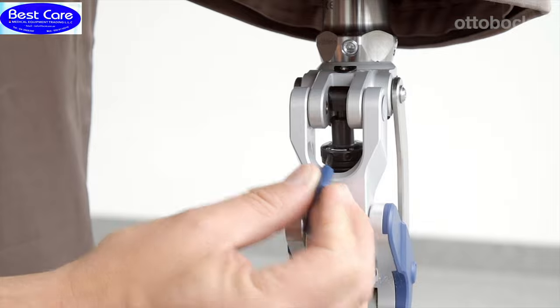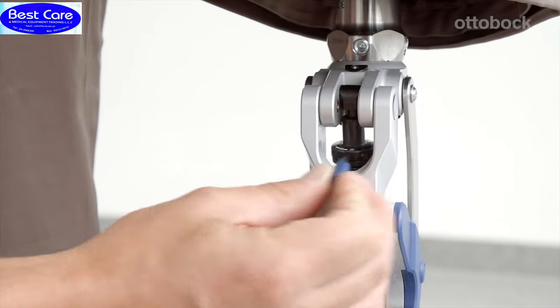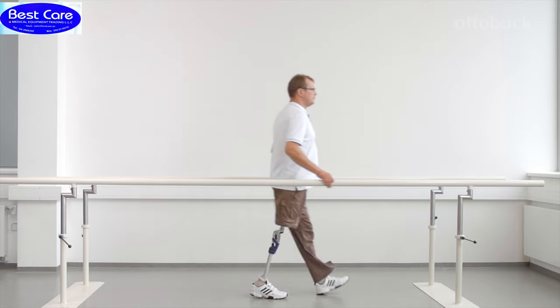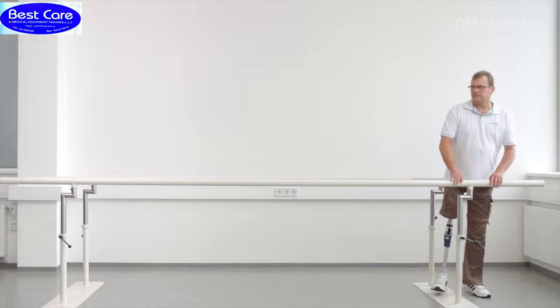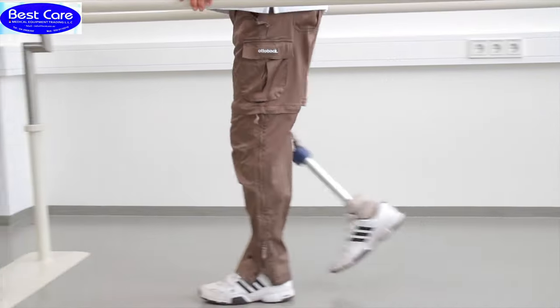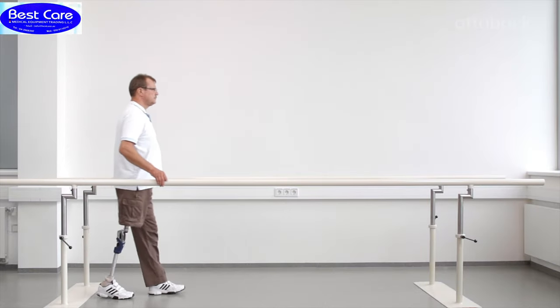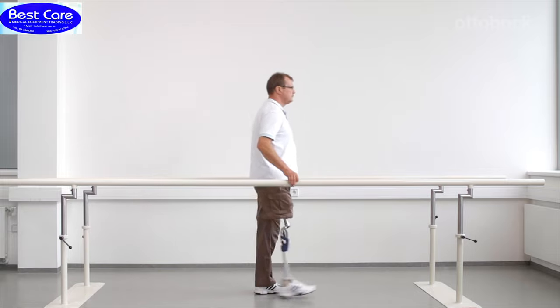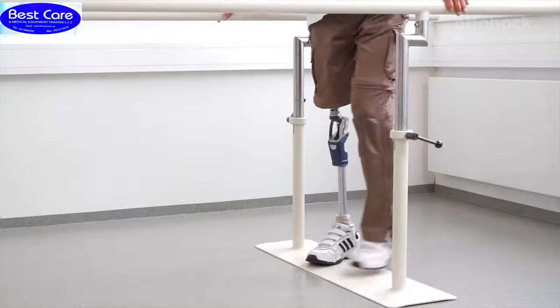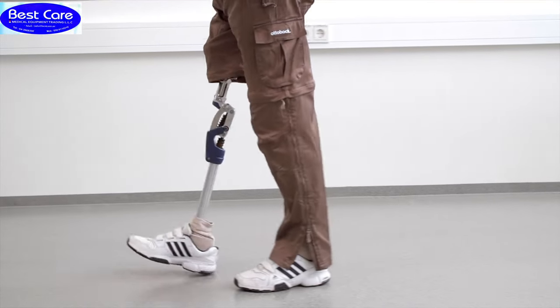Now tighten the extension spring slightly. Make sure that the prosthetic knee is in full extension when the prosthesis is loaded during heel strike. Once the optimal setting for the user is found, it's time to walk at a self-selected walking speed. Walking at different gait speeds is necessary in order to confirm that the swing phase is set optimally for the user. The settings should be comfortable for the self-selected walking speed, and it should still be safe for changes in walking speed.